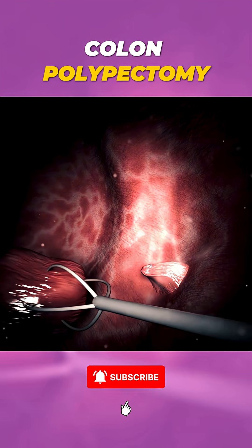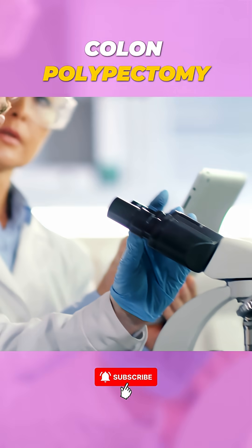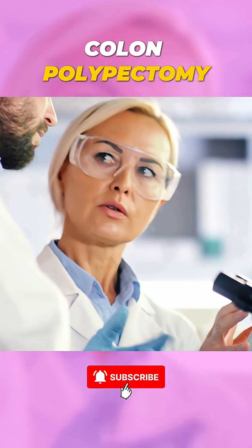The polyp is then carefully removed and sent to a lab for analysis to determine whether it's harmless or requires further treatment.